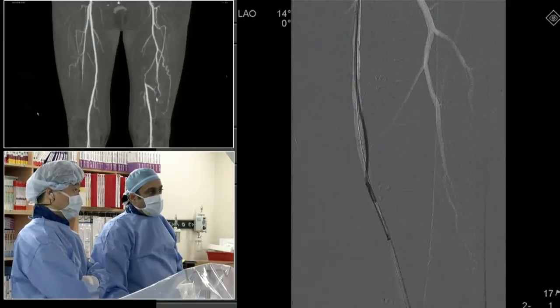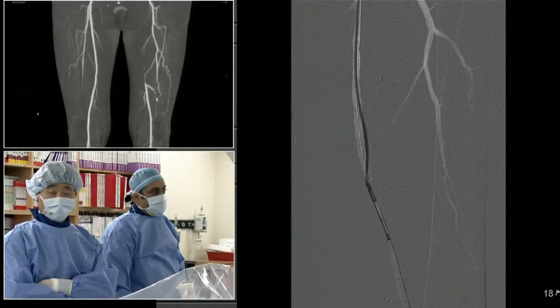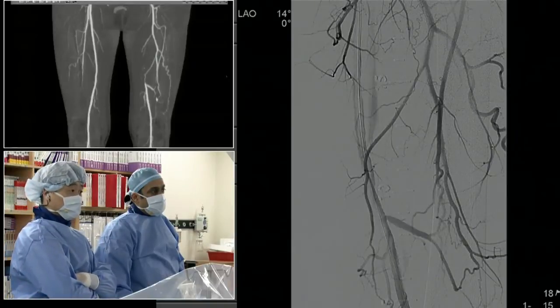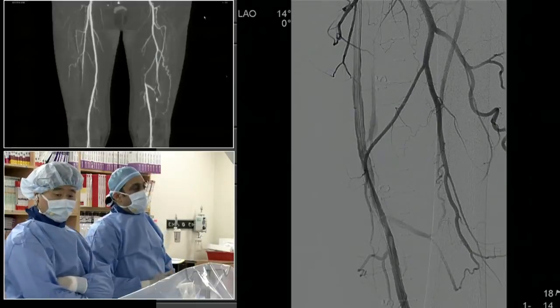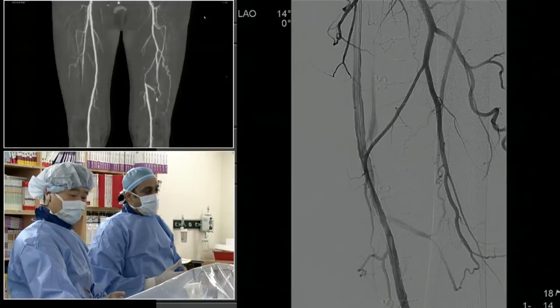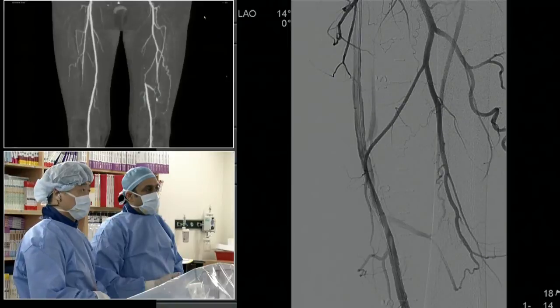So I went back in and did an atherectomy there, just in the last 3 or 4 centimeters. And I have a little bit of a fistula there. Okay, right there. No perf, just a fistula. So I'm going to stop there and just get the moderator and the panel's opinion on what we should do next. We've already moved forward with one option, but I wanted to get people's thoughts on how to proceed here.